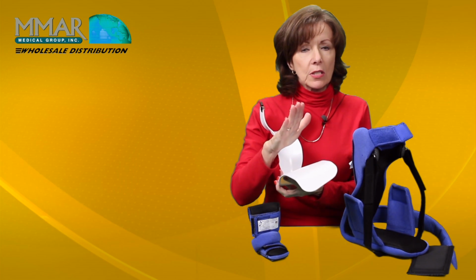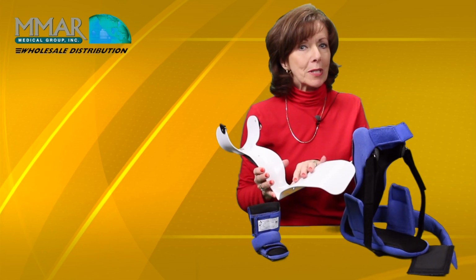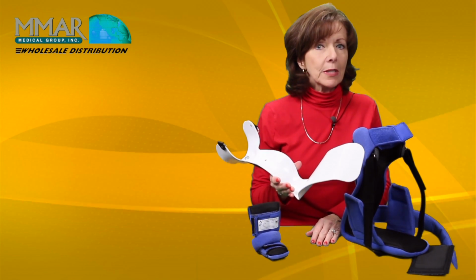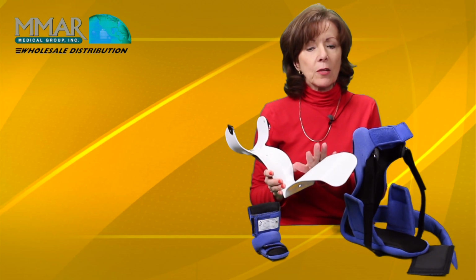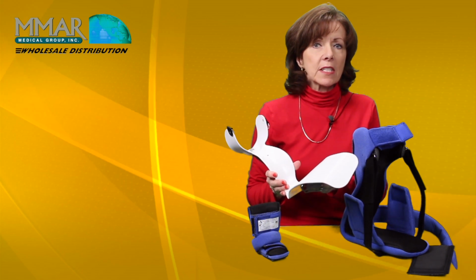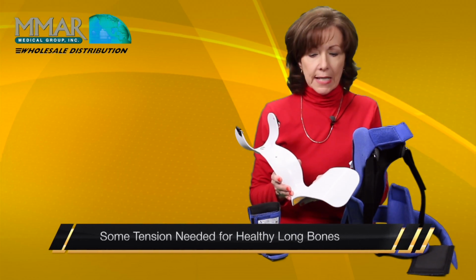You don't make the patient fit the splint, you want to make the splint fit the patient. You can't put a contracture patient in a 90-degree boot. You're going to set them up for shearing, for wounds, and we have to be very careful. Someone diabetic, you create a wound on their heel or somewhere on their foot, they can lose their whole leg, so it's very serious. And again, we have to keep people's feet to where they can stand. Weight bearing is vital for their health and welfare, for the integrity of their long bones. It requires that weight bearing type of tension, that stress, to maintain the minerals in the long bone.